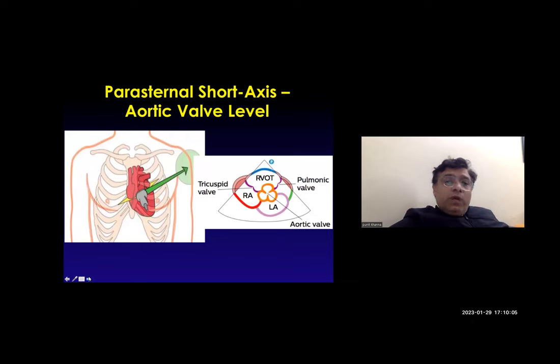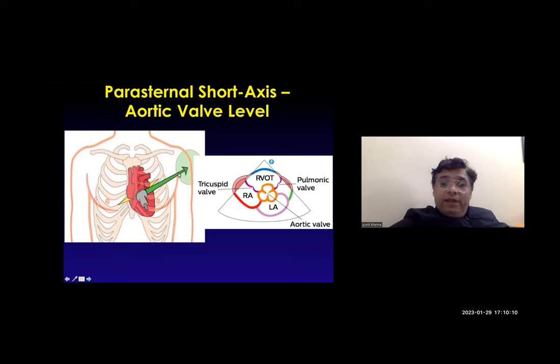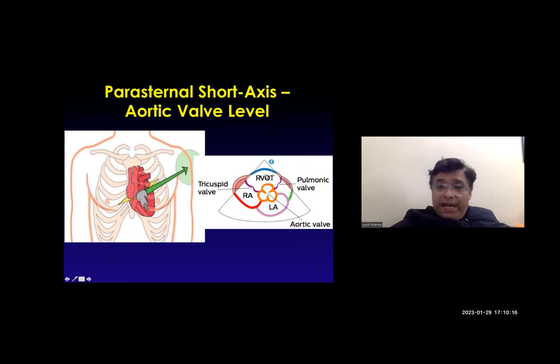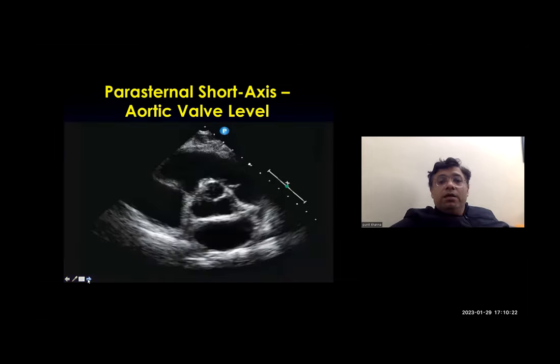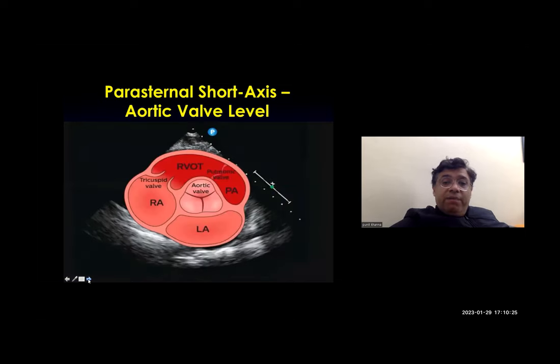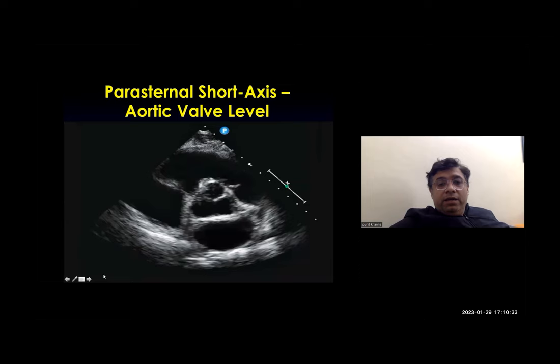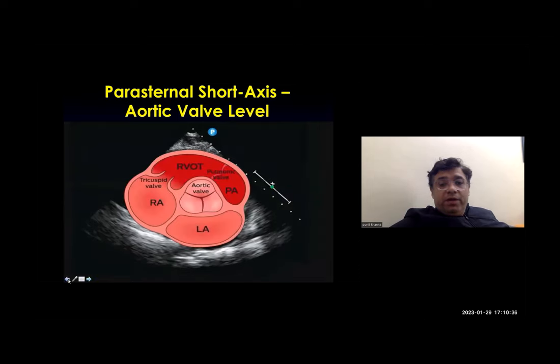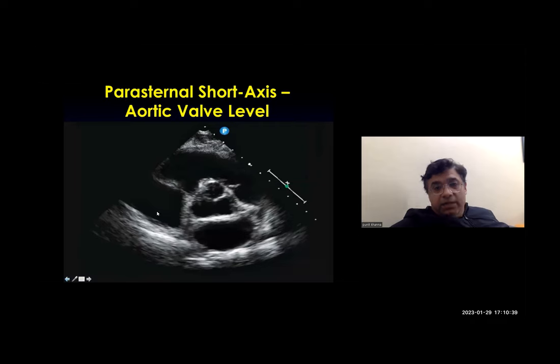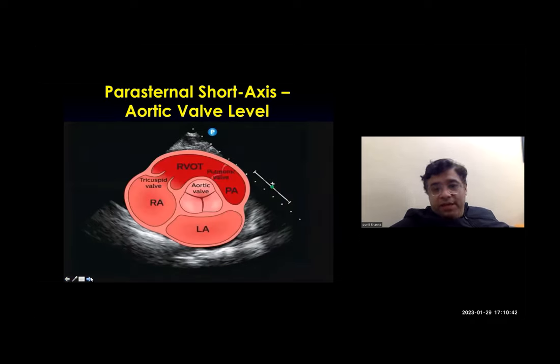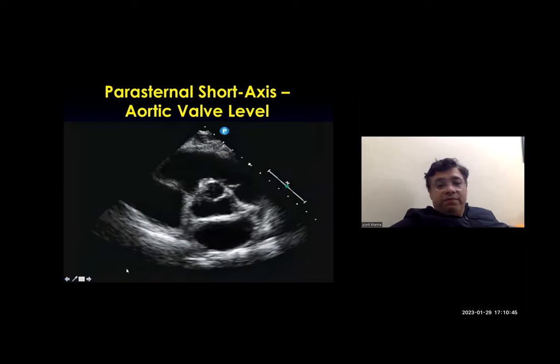At the parasternal short axis view at the aortic level, we will see the right atrium, right ventricular outflow tract, left atrium, tricuspid valve, pulmonary artery, and the aortic valve. Right atrium, left atrium, aortic valve, outflow tract, and pulmonary artery are the key structures at this level.